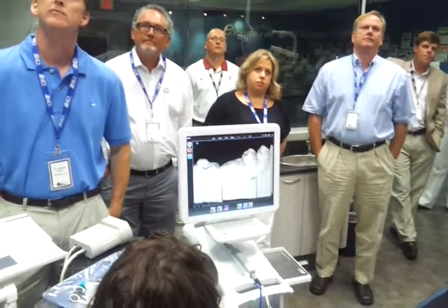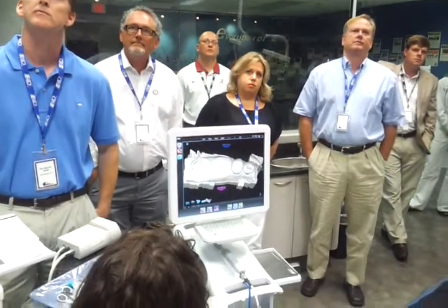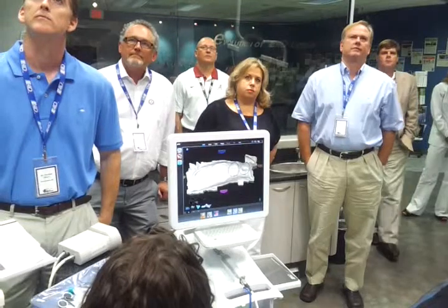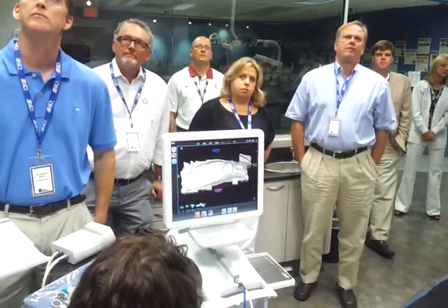And I'm ready to go. I'm going to go ahead and trim my model just like we would chair side, right? I'm going to use my virtual lathe. When I pour up a model, I got to get rid of the garbage. So I'm just trimming away what I don't need. I circle what I don't want.